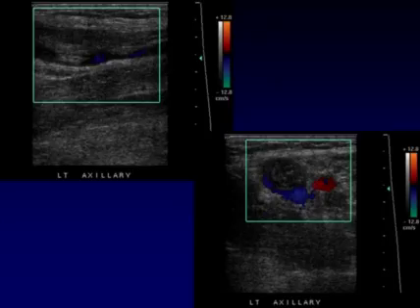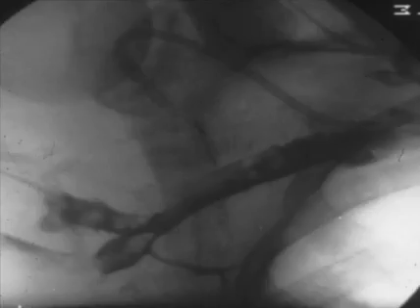The axillary vein can actually get quite large when it's distended by thrombus, as is the case here. Just as in the legs, we often see anechoic or hypoechoic thrombus, but as is the case here, this is a large thrombus which is expanding the vessel. It's bigger than the adjacent artery. This is an acute axillary vein thrombosis.